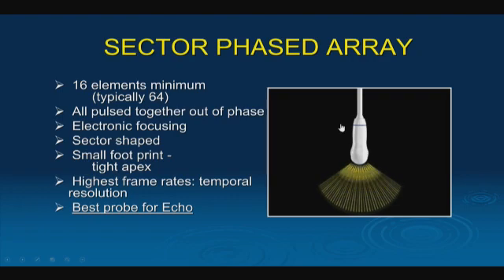The other thing is that phased array transducers have a very small footprint. That is, the contact area of the transducer needs to fit in between the rib spaces, and that's real tiny. Your other transducers have larger footprints, so it's not as easy to see the heart, and the frame rates aren't going to be as high.